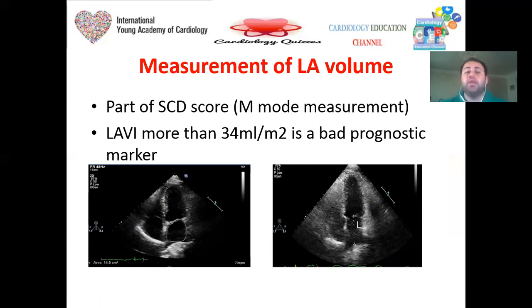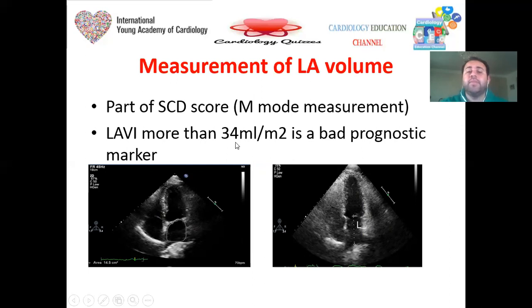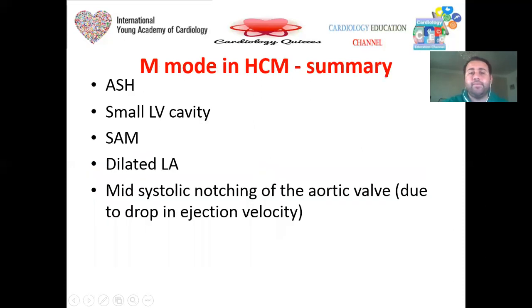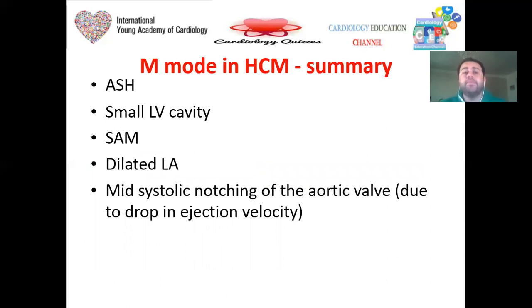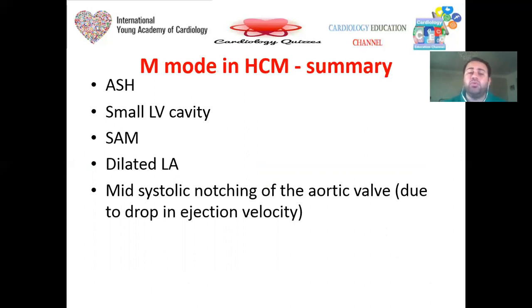Don't forget to assess the left atrium — M-mode measurement of the left atrium is part of the SCD score, and LA size correlates with prognosis and sudden cardiac death incidence. Also measure the left atrial volume index using the area-length method divided by body surface area — if more than 34 mL/m², this is a bad prognostic marker. To summarize M-mode findings in HCM: asymmetrical septal hypertrophy, small LV cavity, SAM, dilated left atrium, and mid-systolic notching of the aortic valve due to complete mid-systolic LVOT obstruction.